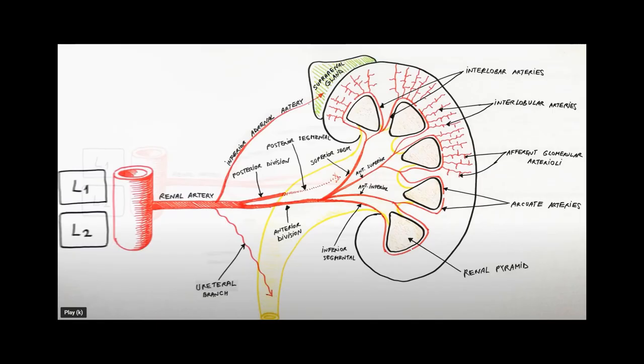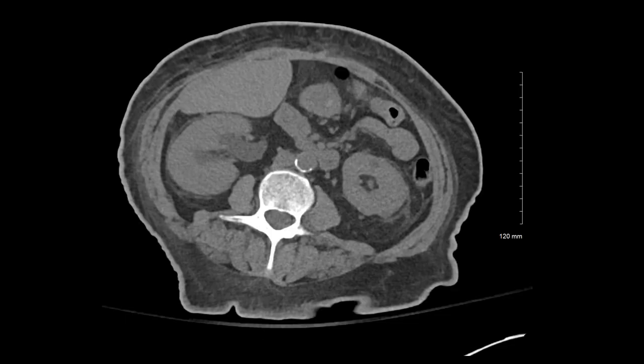And again, also if we can hit a calyx basically directly on the head, we're hitting the ends of these arterioles, which again decreases the risk of causing injury. And I took this little screen grab from a YouTube channel called Anatomy Knowledge. It's pretty good, so if you want to check it out, that's something you can do.